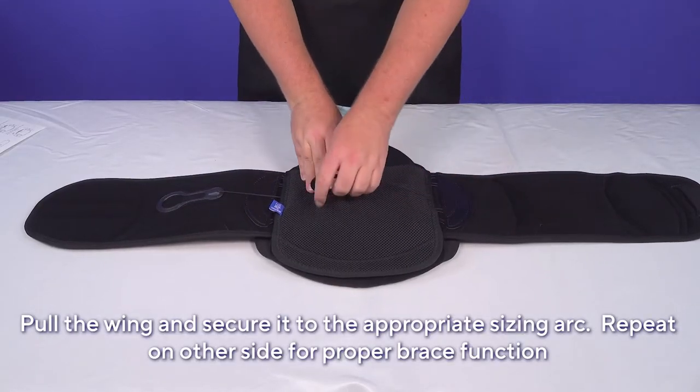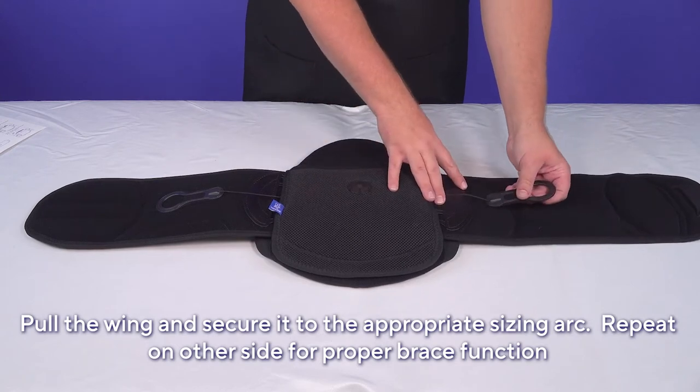Repeat on the other side. For proper function of the brace, both wings must be adjusted.